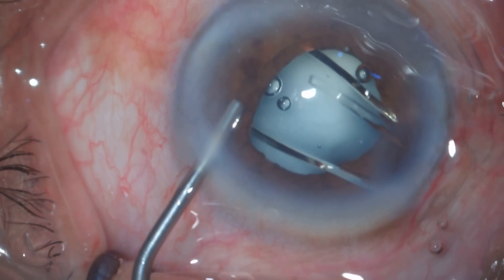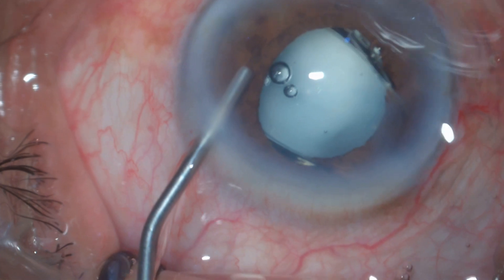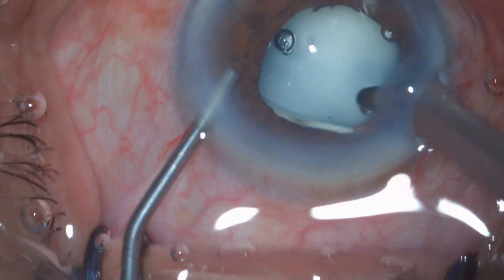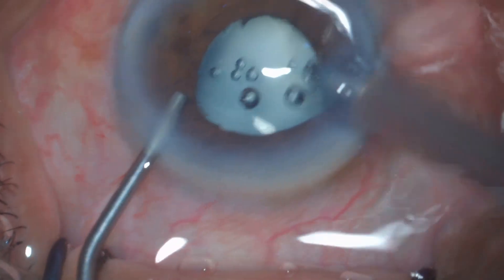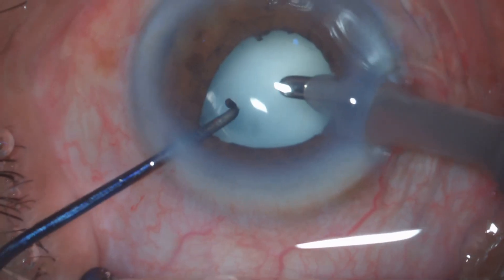This is a hydrophobic single-piece IOL that I'm implanting in this patient, into the bag, with a little hydroexpression. But again I'm thinking — is the surgery complete, or can I do anything else for this patient?